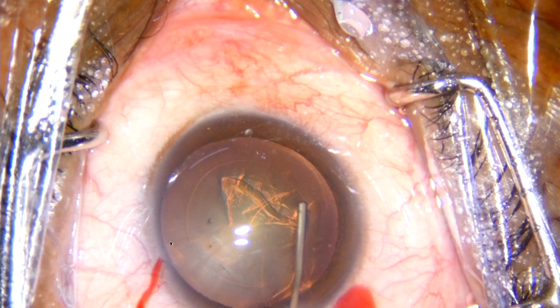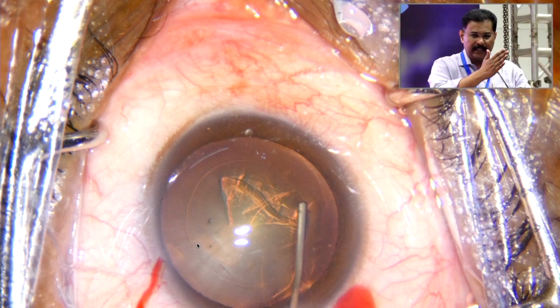Again, hydrodissection in soft cataract. People all the time ask, how much should I inject? How fast should I inject? Keep the syringe outside, press and see, one jet of fluid should come, that's all. And how much is decided when you have a fluid wave.